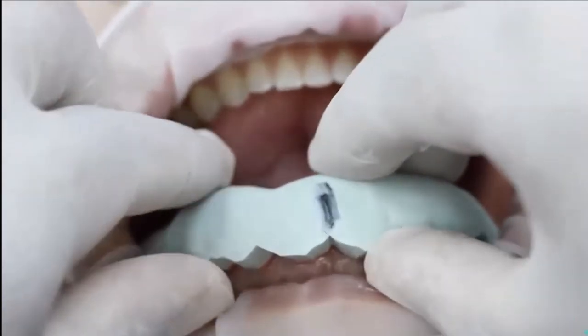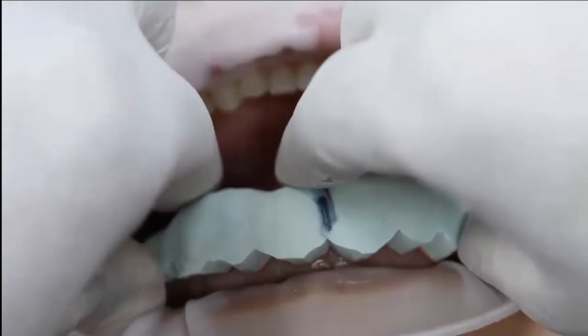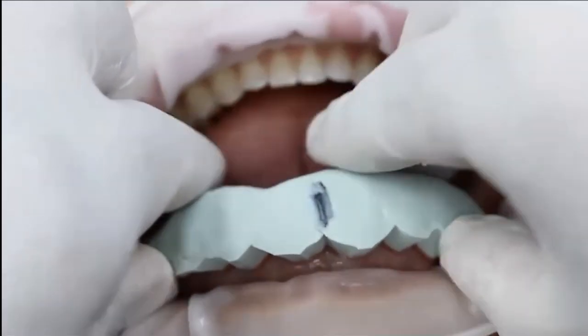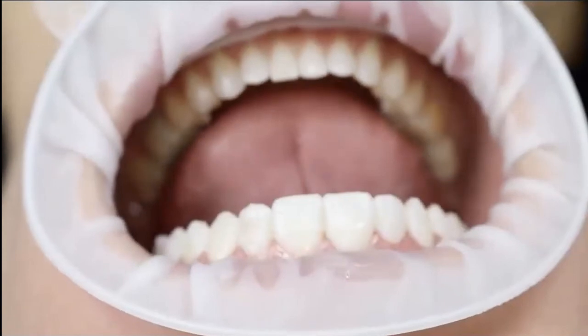When you are removing the silicone key, make sure to first apply some force outward. That way you don't break the bisacryl, and then pull everything down. So this is an option with a gingivectomy.